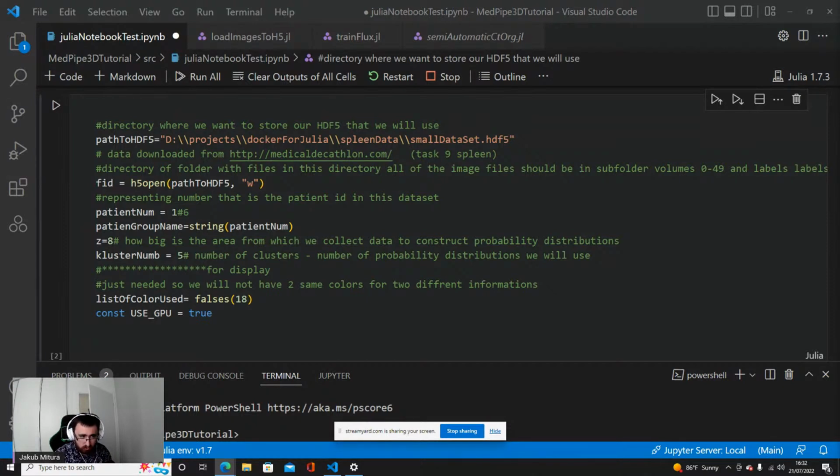Because this is not like typical Python frameworks. This is created with interoperability in mind, and it was very easy to establish basically in Julia. You can visualize my data, visualize your data using my visualizer.